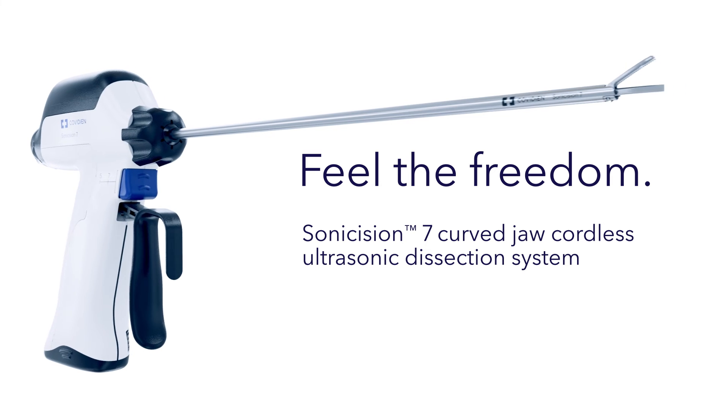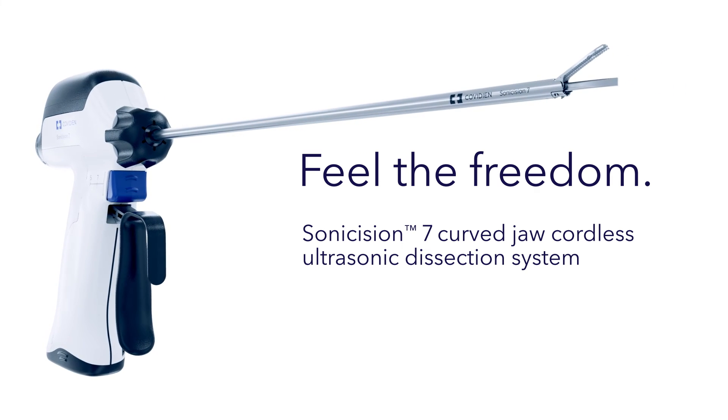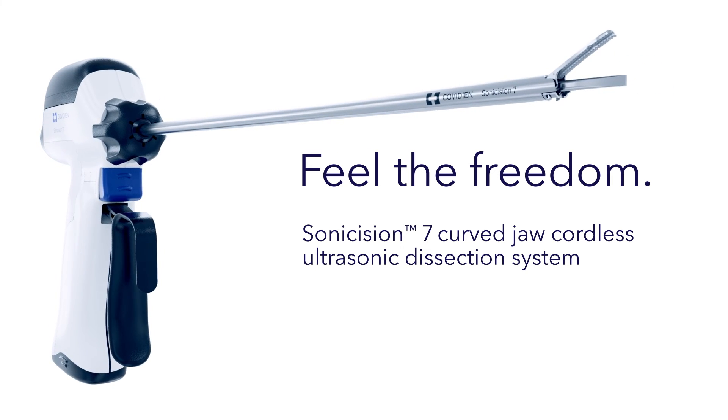The Sonocision 7 curved jaw cordless ultrasonic dissection system. Feel the freedom.